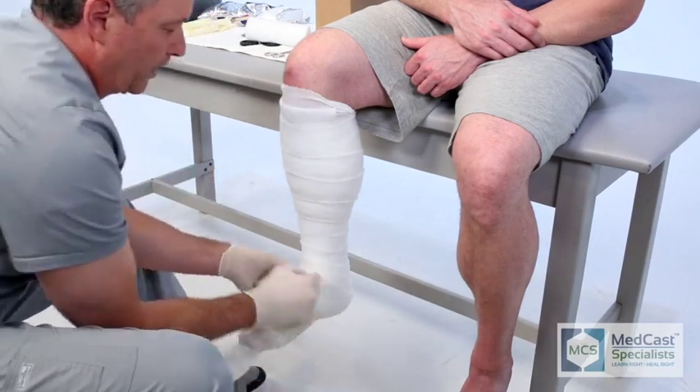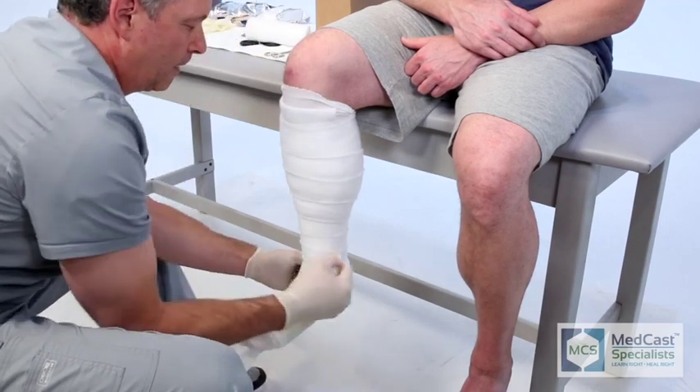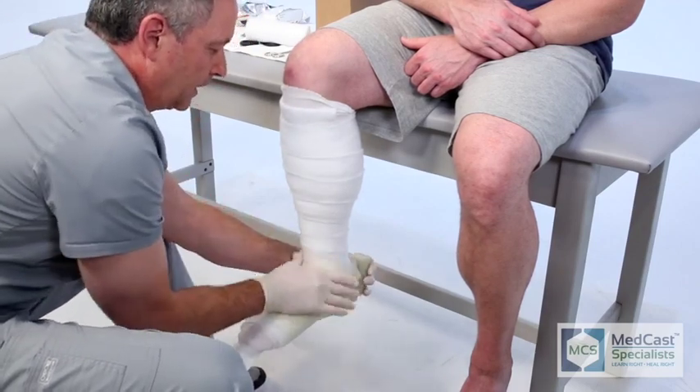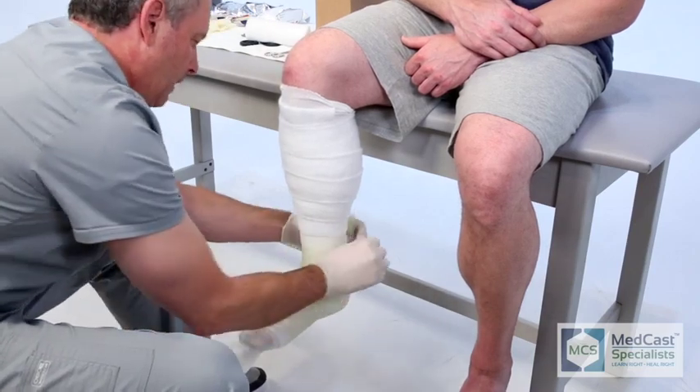You'll notice as Lance started on the toes, the angle he used so he's not going straight across — that way he doesn't cut into either the big toe or the small toe. It's a way that you can have the toes out in an even fashion.